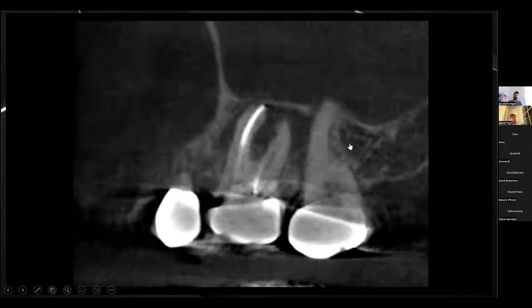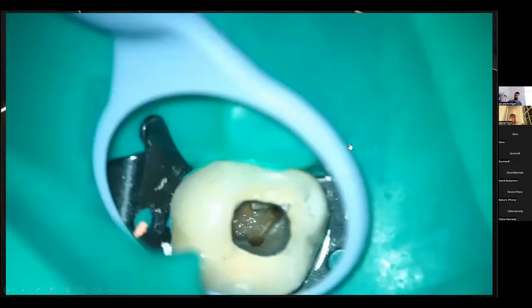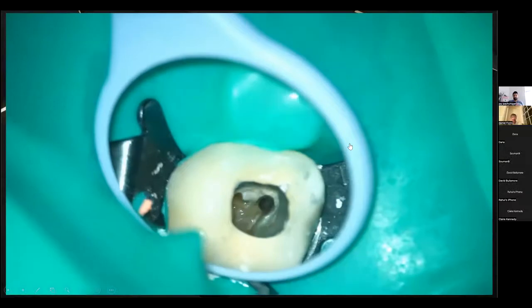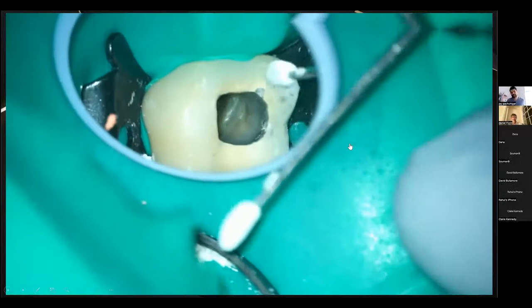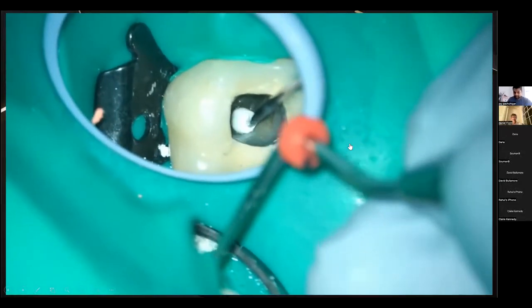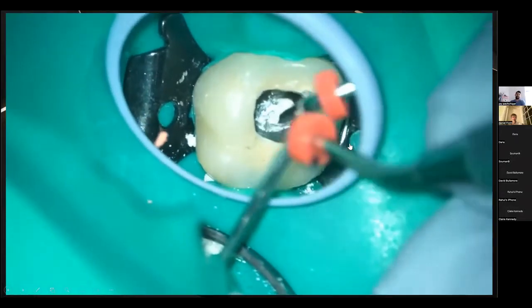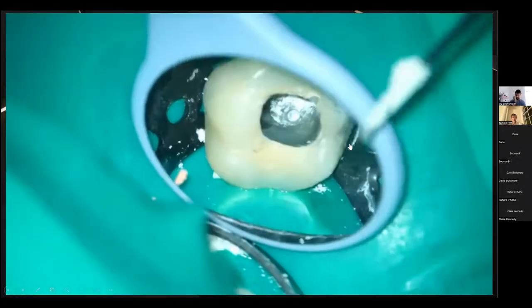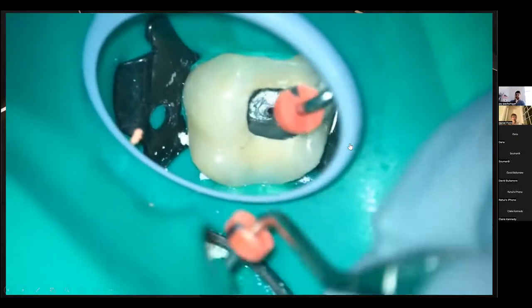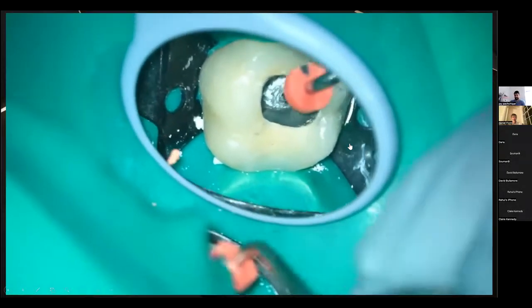You'll see it's going to be a very wide apex over here. So for a case like this, once all that GP was removed, we've gone in with the Bioceramic Putty, and we're planning for the future here because it's very possible that this is going to need some surgical treatment later on. So the putty, it's just much easier to handle than MTA, I find. Quite easy to pack into these canals. So I've just got the small end of my plugger over here, getting into that distal.